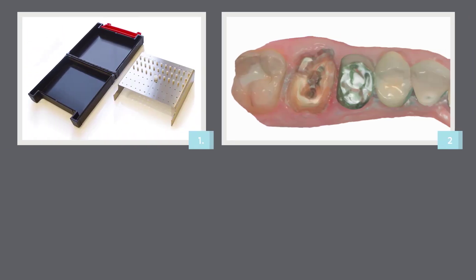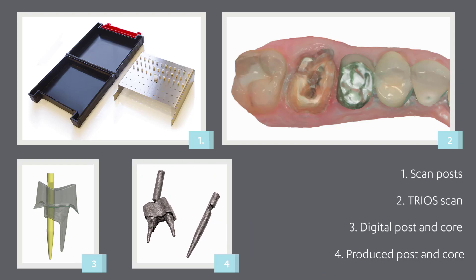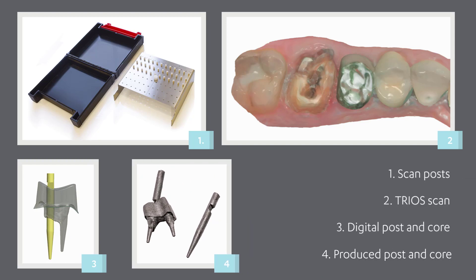In this video, we will demonstrate the workflow for post and core. With 3Shape Trios, it's easy to scan a post and core case and send it directly to the lab.